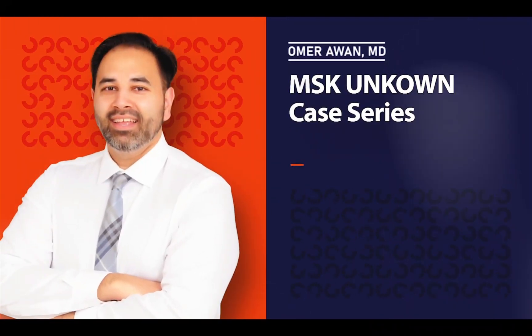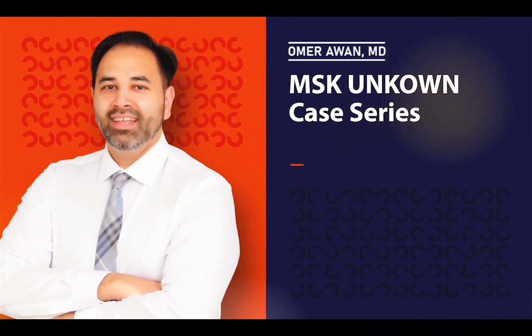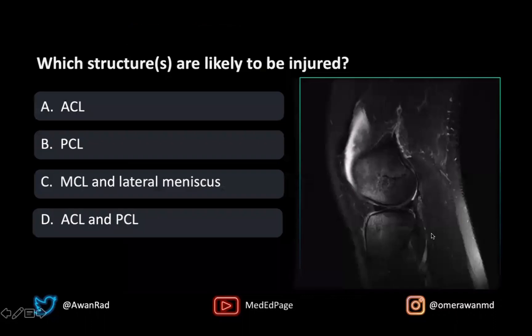Hello, and welcome to MSK Unknown Case Series, Case 87. This is a sagittal T2 fat sat MRI image through the knee. The high-yield question is: which structure or structures are likely to be injured?